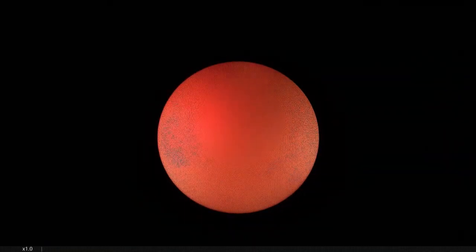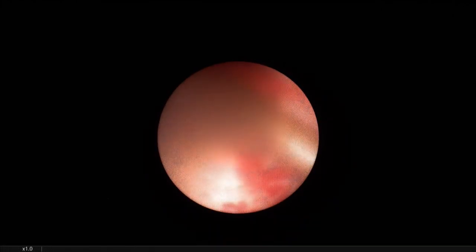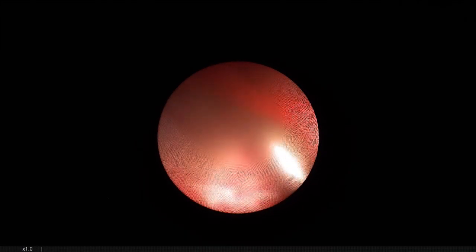But maybe we are not completely inside the calyx. We are seeing the stone. The guide wire. This is the calyx. This is the pelvic cavity. The ureteral catheter, the balloon. And now we can position the Amplatz sheath under nephroscopic vision. I'm forwarding the Amplatz sheath under nephroscopic vision.